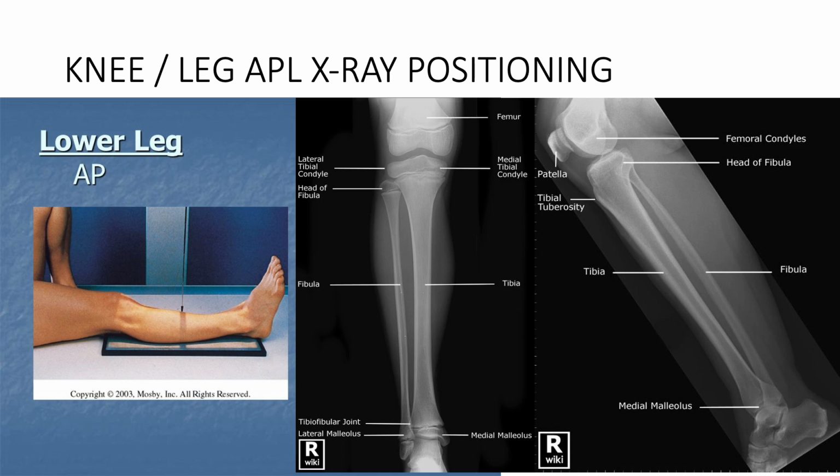In the practical exam, it's just simple identification of a particular part of a particular limb, so it's not hard. I won't be asking complex questions on practical.